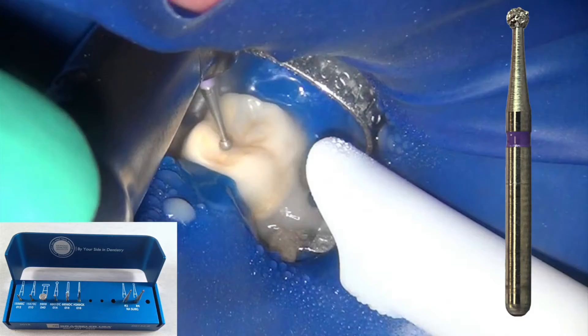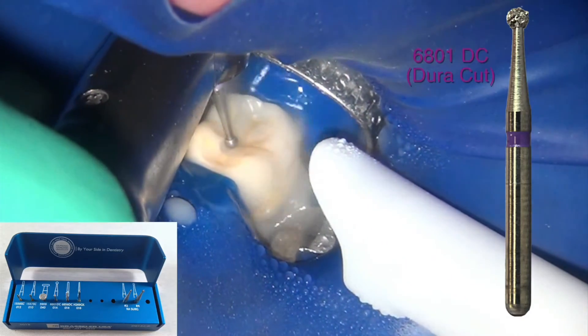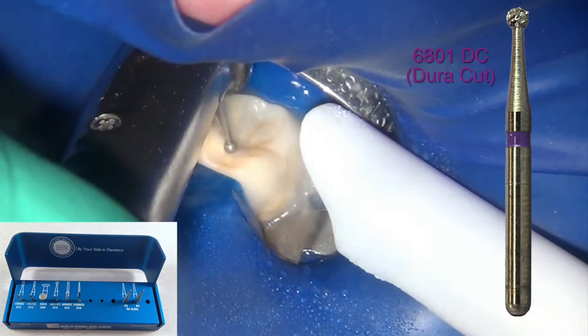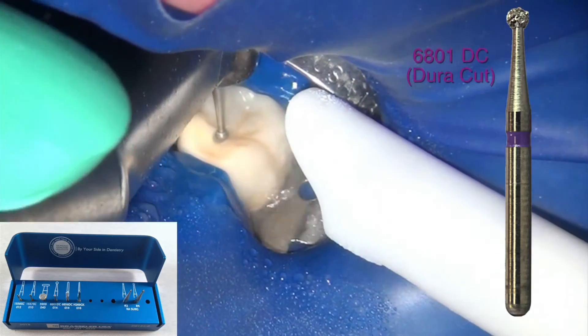This burr with the purple band around it, called DuraCut or 6801 DuraCut, is specifically designed for harder materials — with lithium disilicate, the Emax's of the world, as well as zirconia crowns in mind.